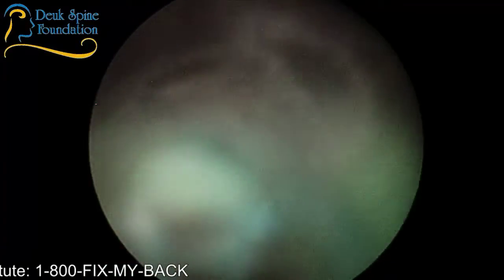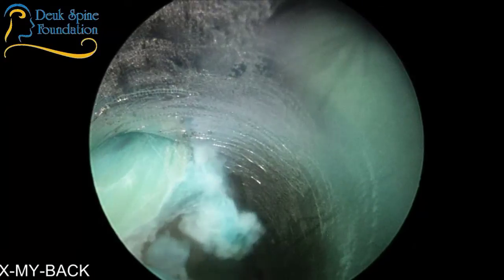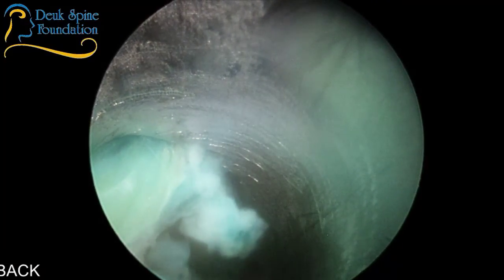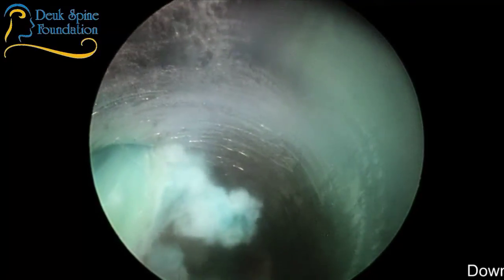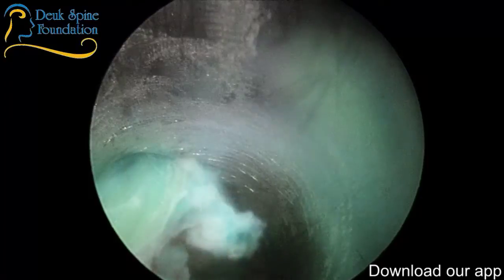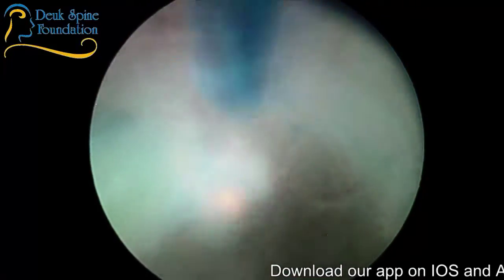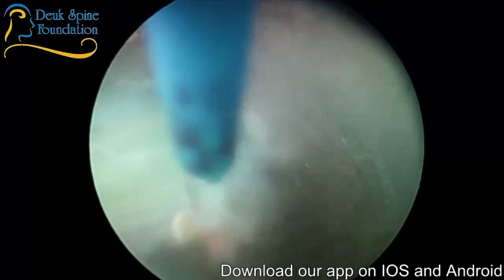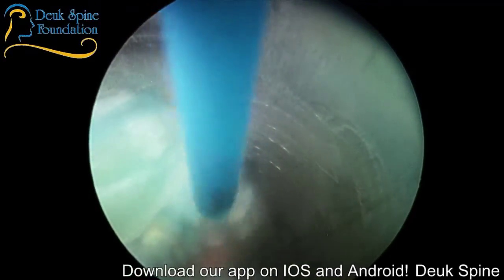Now let me just make sure. I may want to take some of these little pieces out. Let me have the laser. Now these really aren't pushing on the nerve, but they're just next to it, and I don't want to take any chances and leave anything behind that we should. Yeah, I just take 2 seconds here. Now because the nerve is kind of exposed, I have to be super careful not to get it. I'm literally working just underneath it.